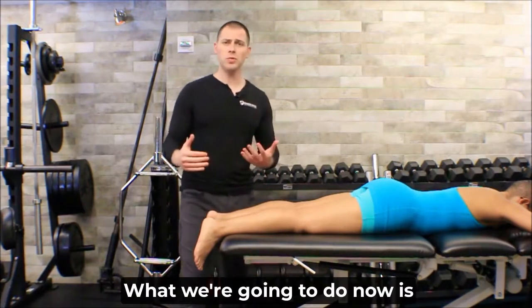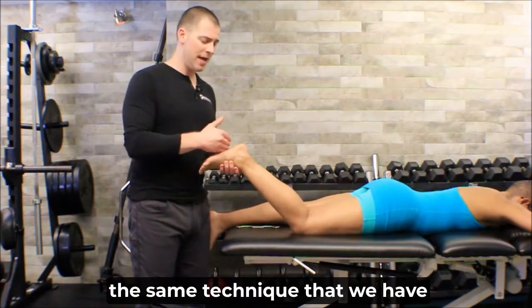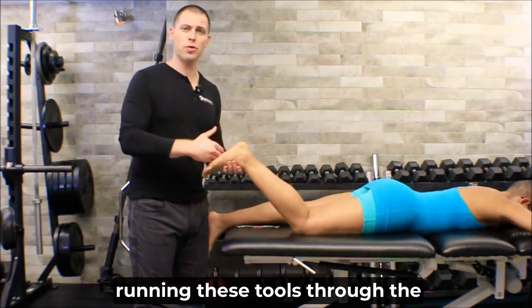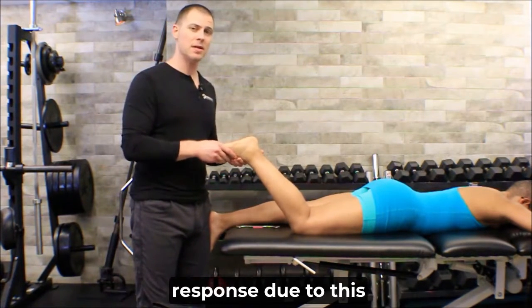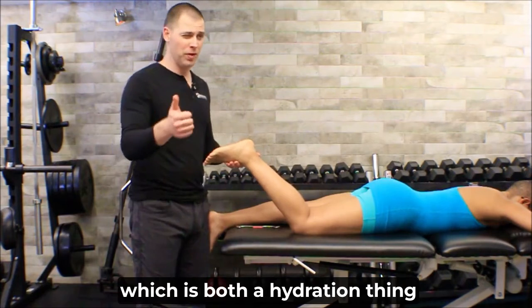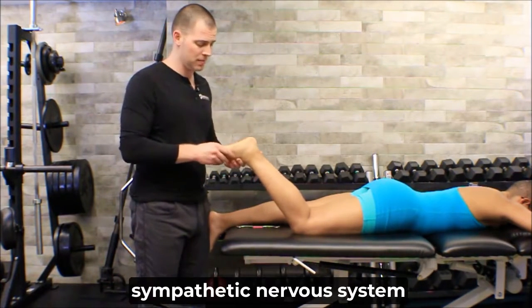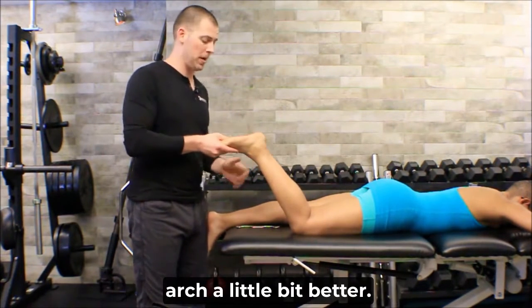So what we're going to do now is we're going to go ahead and do the same technique that we have been doing of running these tools through the plantar fascia in hopes that in response, due to this strain hardening, which is both a hydration thing and stimulation of the sympathetic nervous system thing, right, that we get an increase in stiffness that'll support the arch a little bit better.